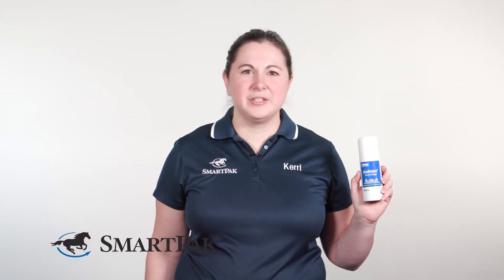The most unique thing about this spray is that it dries into a protective layer that doesn't require any bandaging. If your horse is like mine and manages to injure themselves on anything and everything, you'll really appreciate this feature.